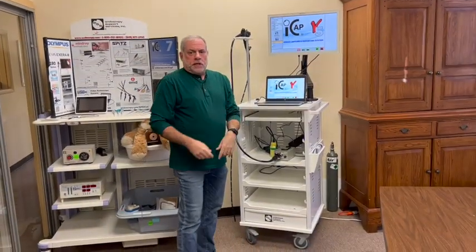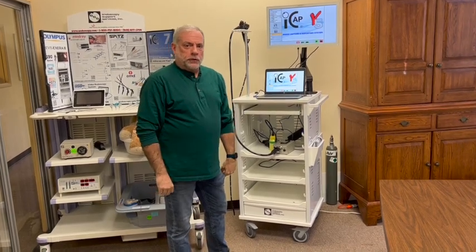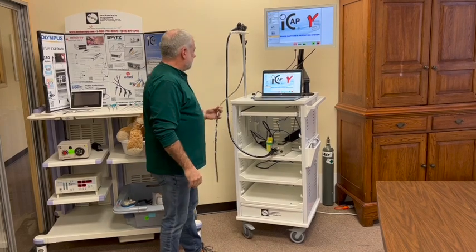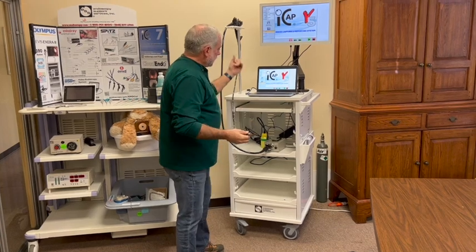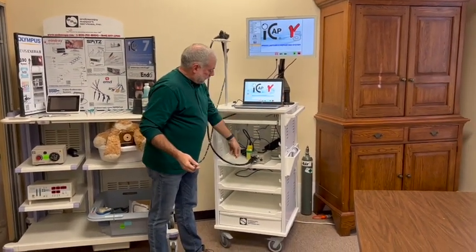Hello everybody, this is James Burns from Endoscopy Support Services. Today I'd like to show you our USB endoscope. This is a one-and-a-half meter USB scope that can be used for small animal or large animal upper airways. We simply connect it via USB through the connector here to the laptop, which connects to the scope.